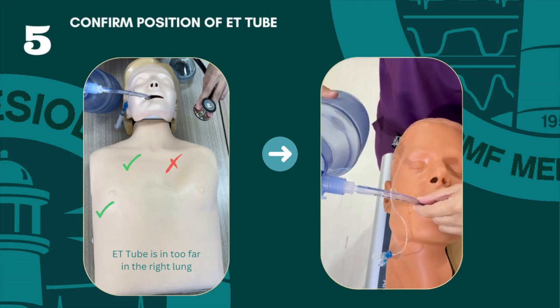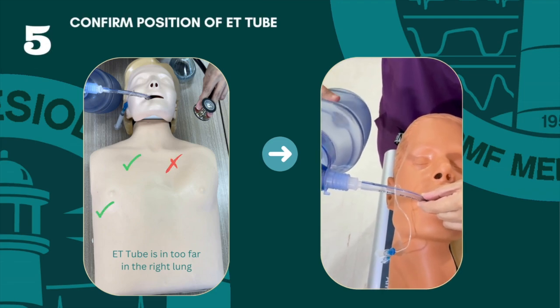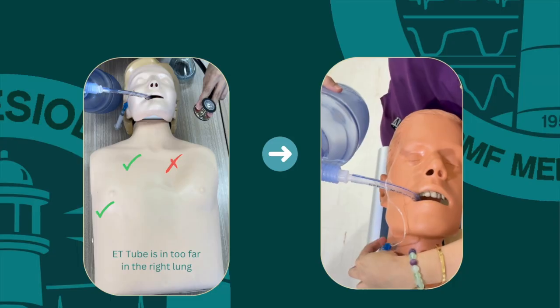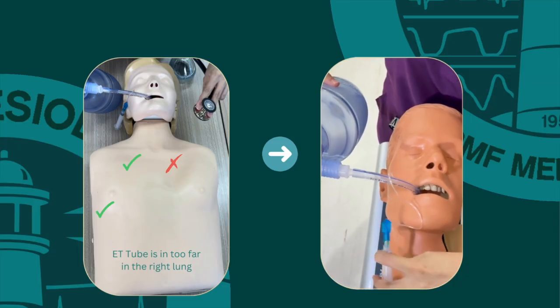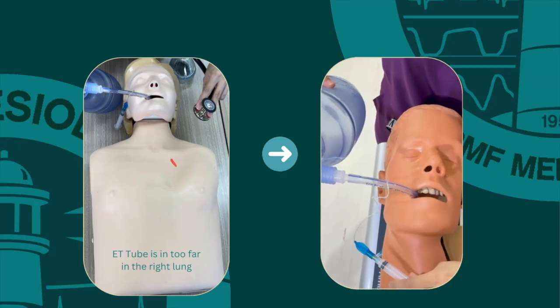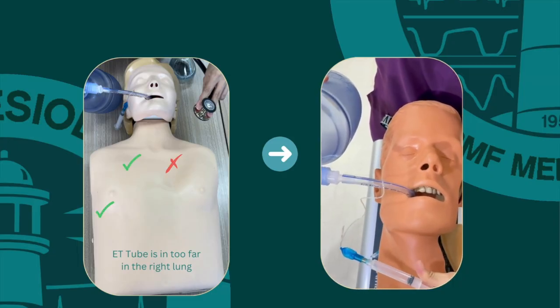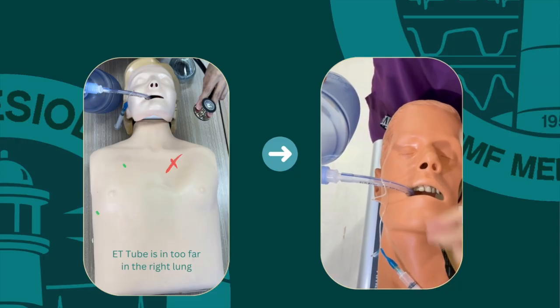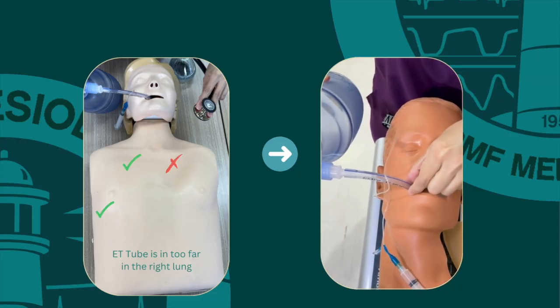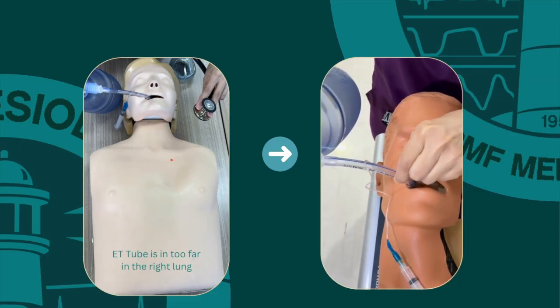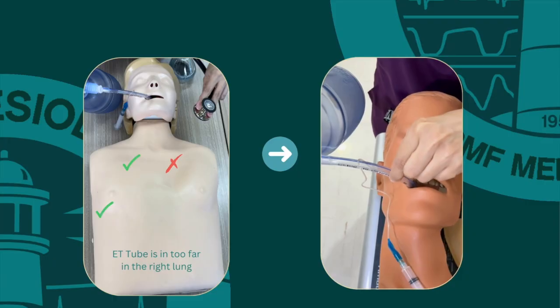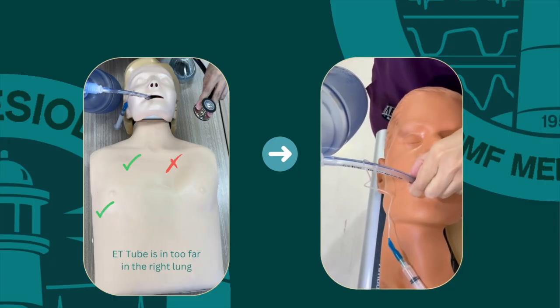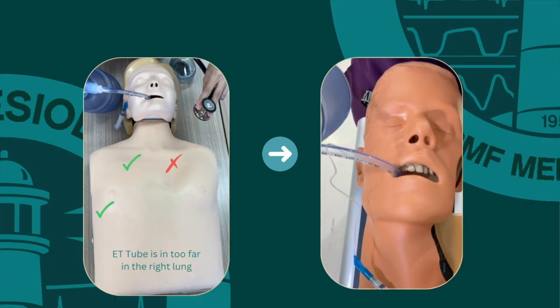If upon auscultation the tube is in too far into the right lung, deflate the cuff and withdraw the tube slowly 1-2 cm. Re-inflate the cuff and re-check the position of the ET tube. You may adjust the ET tube depth until you achieve equal bilateral breath sounds.